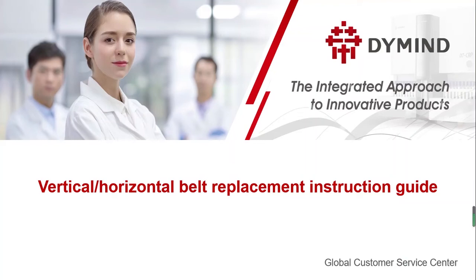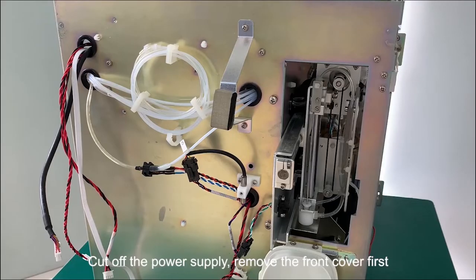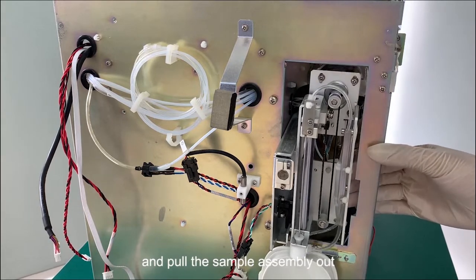This video shows how to replace the vertical and horizontal belt. Cut off the power supply, remove the front cover first and pull the sample assembly out.